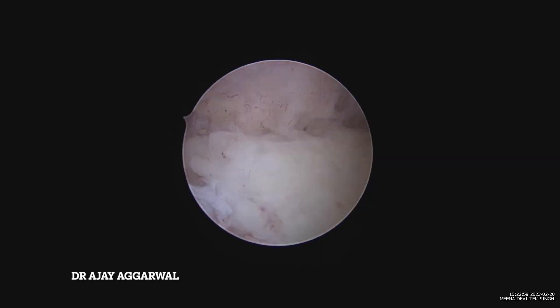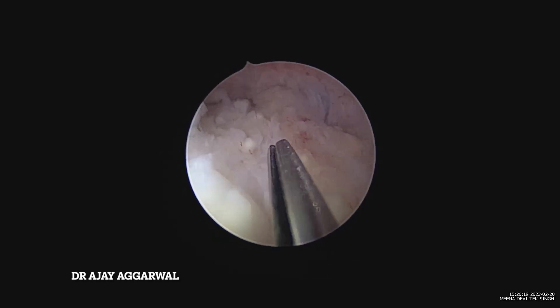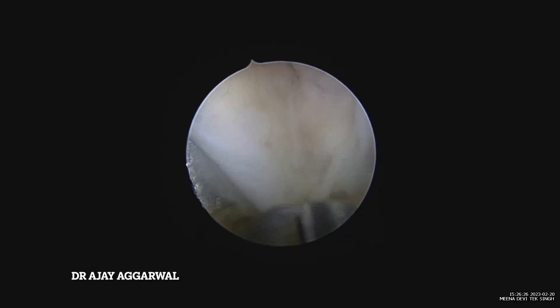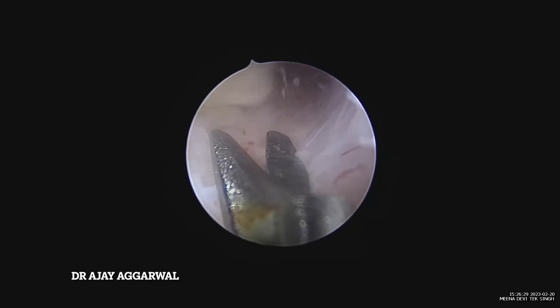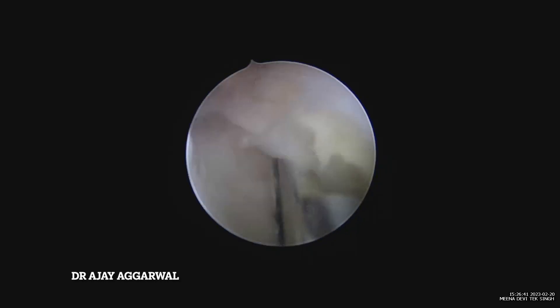After giving a few cuts on the fundus, we can see the underlying normal tissue and the normal pattern of the fundus. Posteriorly, I could identify that the entire tissue is basically caseous necrosis — this was a clear-cut case of tuberculosis. Now I want to excise this entire caseous necrosis. I have made my scissor horizontal and am shaving it off from the underlying normal tissue. My scope comes out, I get a zoomed-out picture, then go back in with the entire assembly.